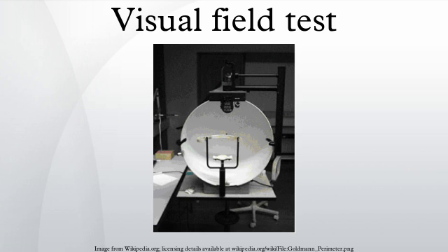Microperimeter. The microperimeter assesses the macular function in a computerized way. A 2012 observational study by Paliserai et al. found a significant improvement in both visual acuity and fixation treating age-related macular degeneration or macular myopic degeneration with biofeedback treatment through the MP1 microperimeter.